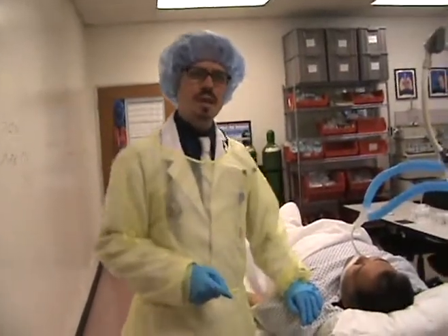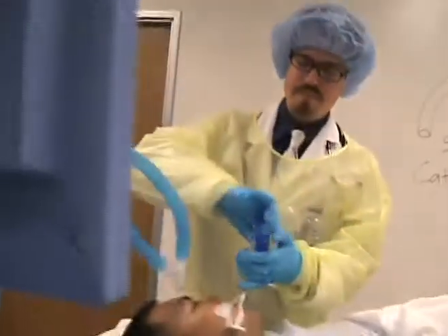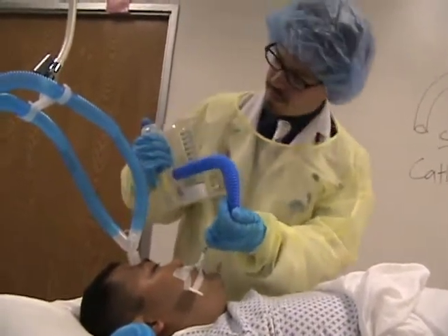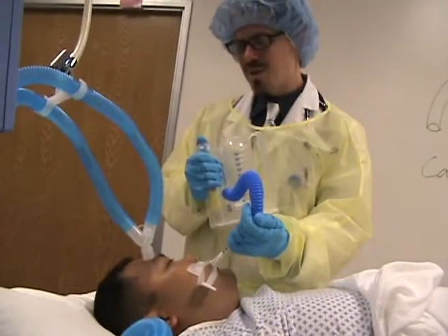For step eleven of our sheet, we're going to go ahead and perform any ordered therapies for this particular patient. Our friend here has an incentive spirometry ordered for him, so let's go ahead and perform that. Sir, I'm going to want you to inhale as hard as you can. Maybe you'll do better tomorrow.